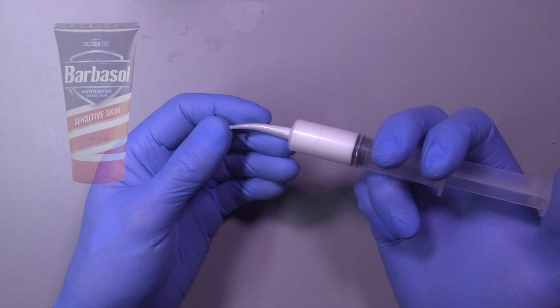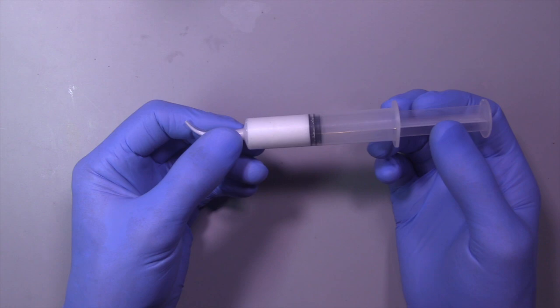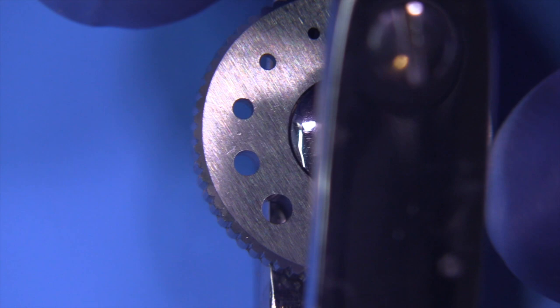Let's take a look at another little tip I have, and that's to use brushless shave soap — this is from Barbasol. I put a little 10cc syringe so I can dispense this on the underside of the rubber dam when we're placing it.